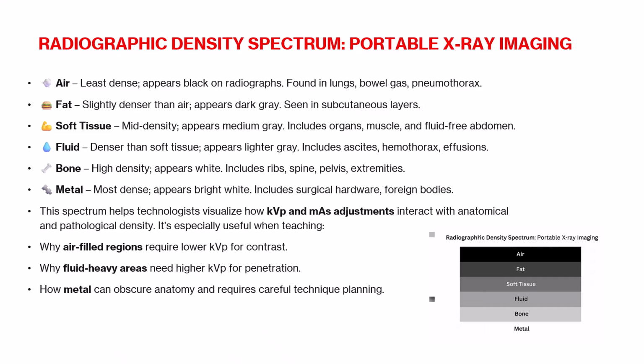In this segment, we highlight a foundational truth for portable radiographers. Extremities measuring 15 cm or less can be imaged effectively without a grid, using a consistent manual technique. This approach simplifies decision-making and speeds up workflow, especially in trauma bays, NICUs, and mobile rounds.